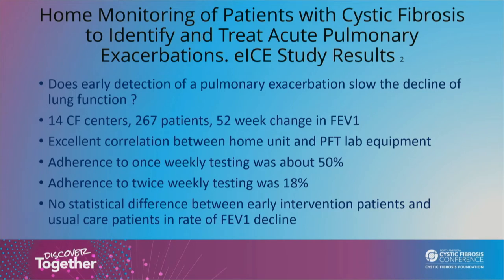And another one of the things that we found is they had really good correlation between their home unit and the PFT lab equipment. For anybody that's just starting out, there's a lot of different home units out there, but as long as they are FDA approved and use the GLI standards, they should provide quality results. A lot of that goes back to the education that you're going to provide to your patients, because I think that's key to getting good results out of these home spirometers.